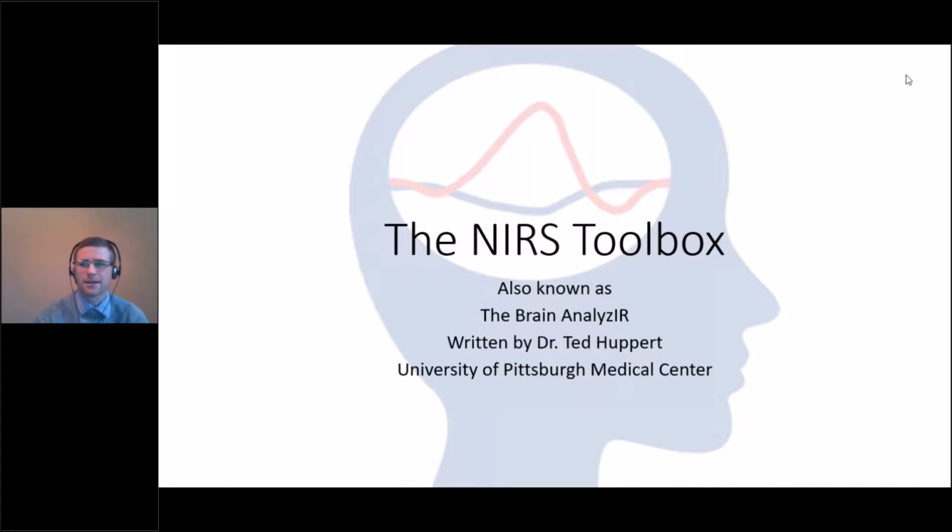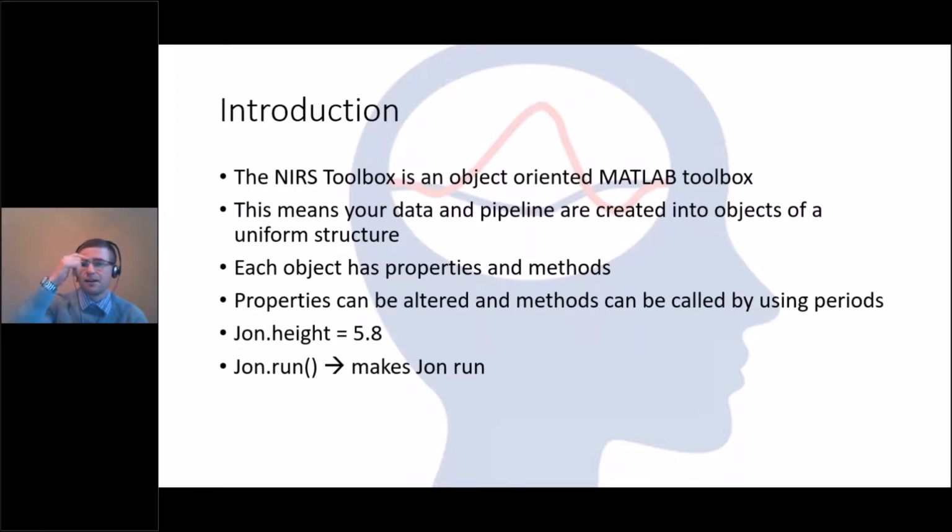That being said, today's talk will be over the NIRS Toolbox, which I imagine a handful of you guys have used. The Toolbox itself was written by Ted Huppert at the University of Pittsburgh Medical Center and has just gone through a revamp of the name. So it's now also known as the Brain Analyzer with a clever IR at the end for infrared. The toolbox itself is an object-oriented MATLAB toolbox, so you do need MATLAB to run it.